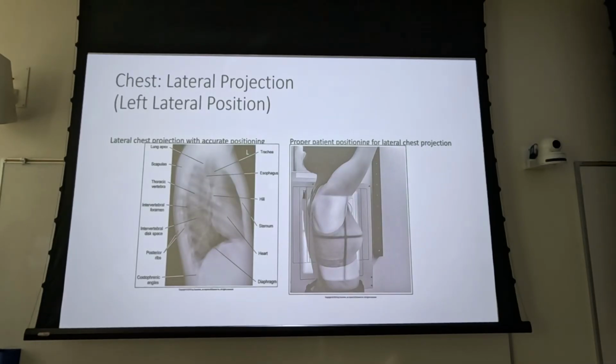It's hard to get that perfect superimposition. I won't say it's impossible, because you do it sometimes, but to consistently get a perfect lateral, or the appearance of a perfect lateral, is very, very difficult. So give yourself a little bit of leeway. If you see a little bit of separation there, blame it on the divergence, blame it on the magnification. Wasn't my fault. Most of the time you blame your patient, right? You moved. Even if you didn't, you moved. You must have breathed. Well, now we've got something different we can blame it on.